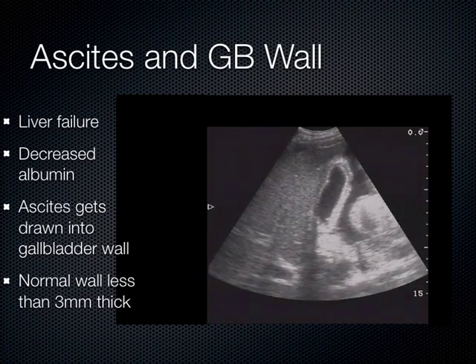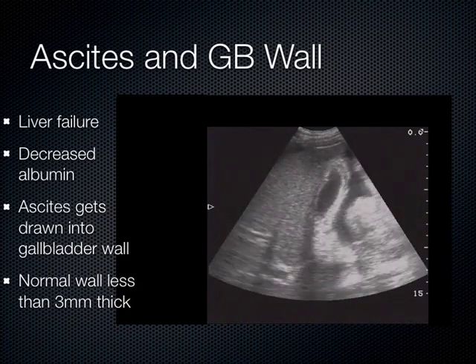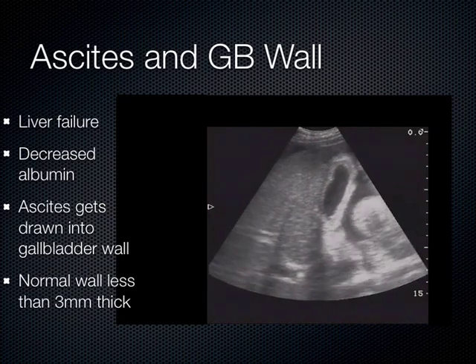So what happens when that happens is the gallbladder contracts down and the wall itself appears falsely thickened, which is why, if I'm really curious about a patient's gallbladder wall, I want to measure it, I try to do it if they haven't eaten for at least 4 or 5 hours. That's the reason why we do that sometimes.